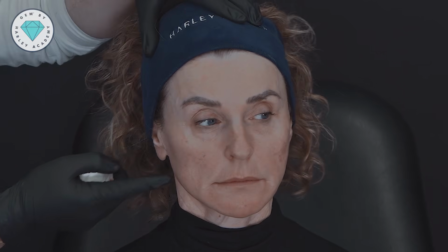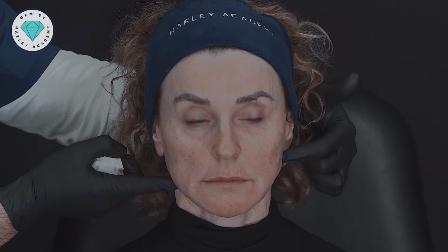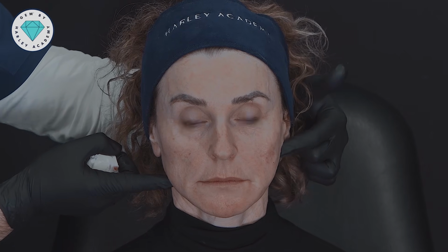Very nice. So we're starting to get this lift along the jawline in particular. This is significantly lower than the height of this over here. So we start to see this lifting effect. Head back. So now we're going to focus on the medial midface, and I'm going to do the drawings on this side to illustrate the anatomy that's relevant for that treatment.